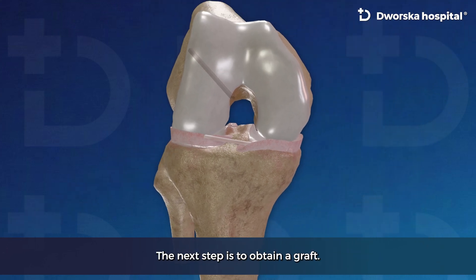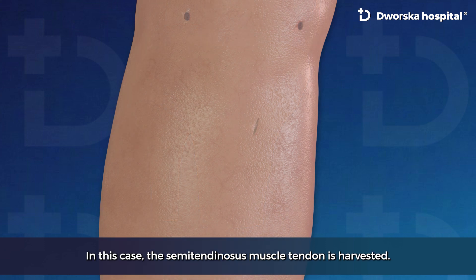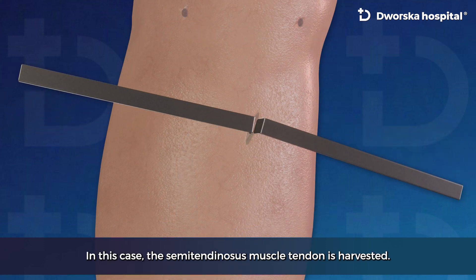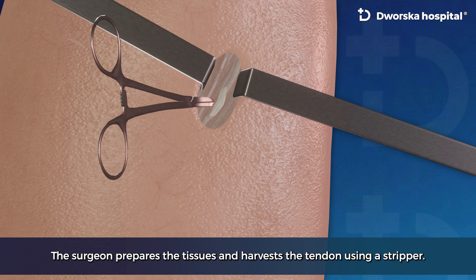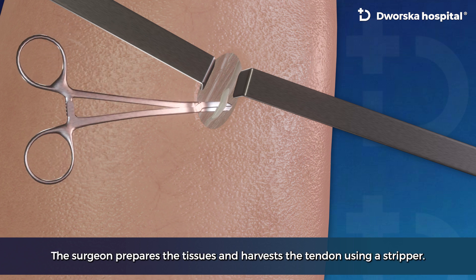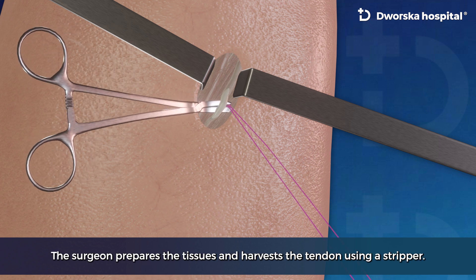The next step is to obtain a graft. In this case the semitendinosus muscle tendon is harvested. The surgeon prepares the tissues and harvests the tendon using a stripper.